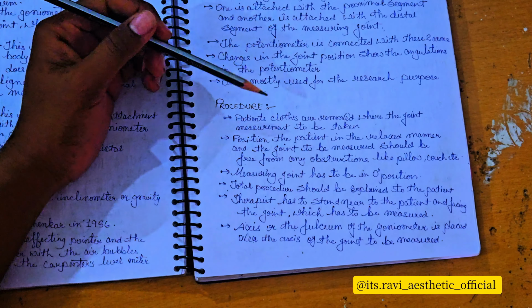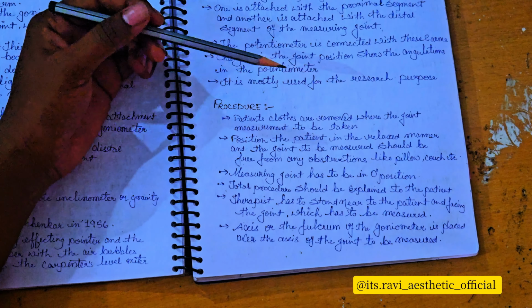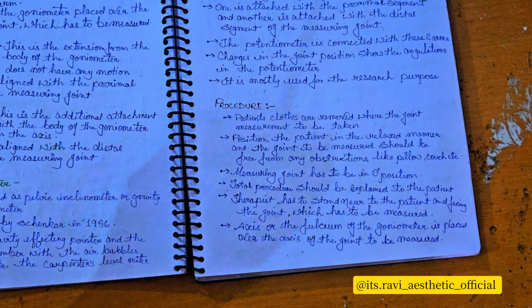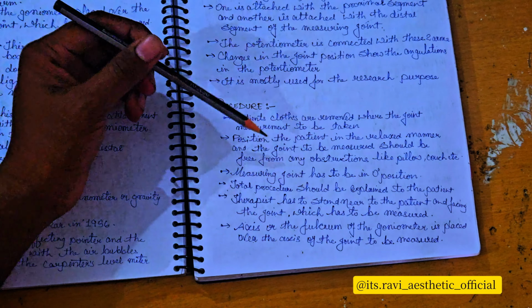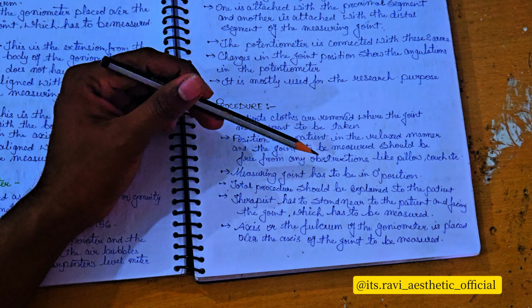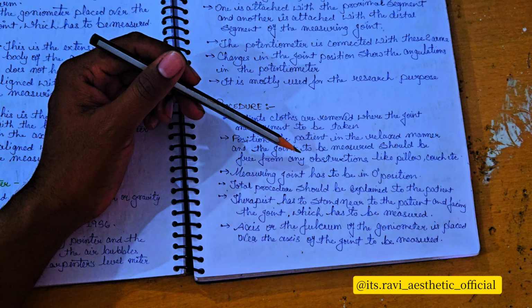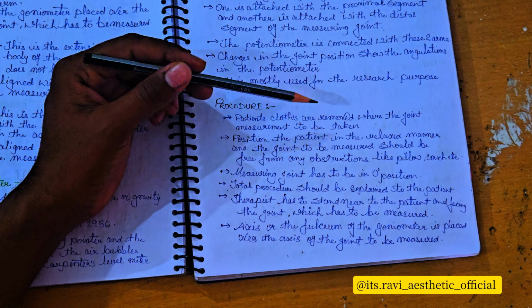The patient's clothes are removed where the joint measurement is to be taken. If we are measuring the elbow joint, make sure the clothing over the elbow joint is removed, because the actual range will not occur if tight clothing is worn. The patient should be in a relaxed position and the joint to be measured should be free from obstruction like pillow and couch. Don't use a pillow or couch for relaxation, but make sure the patient is in a supine or relaxed position.